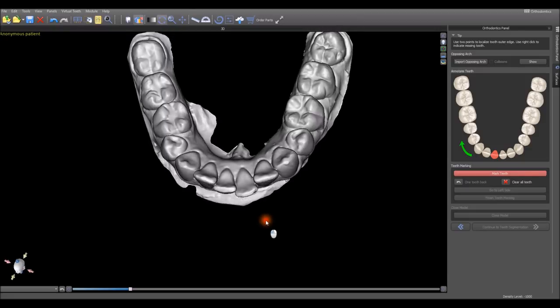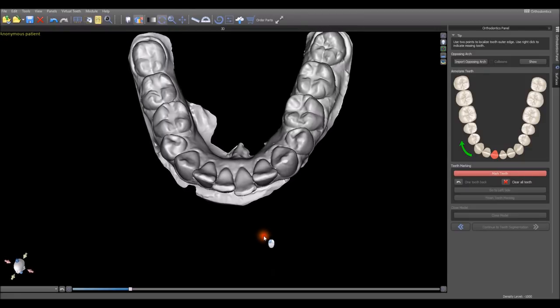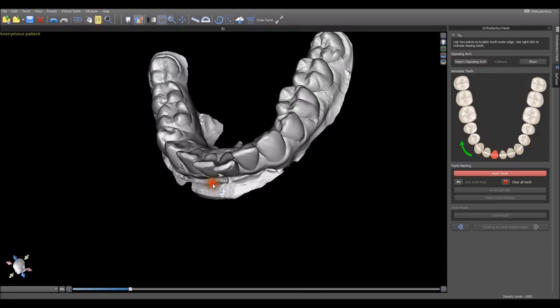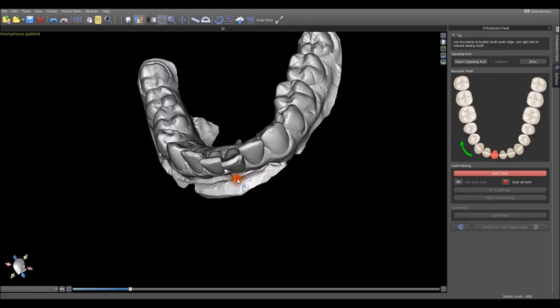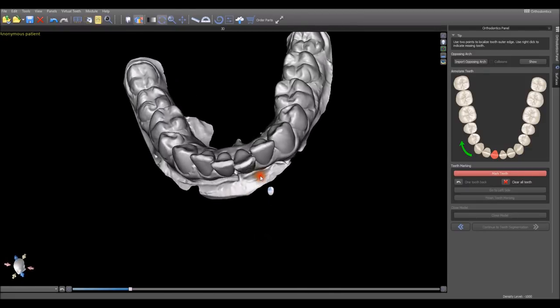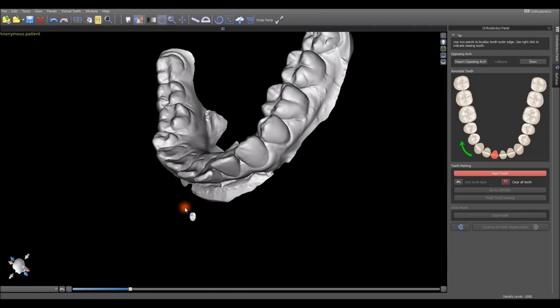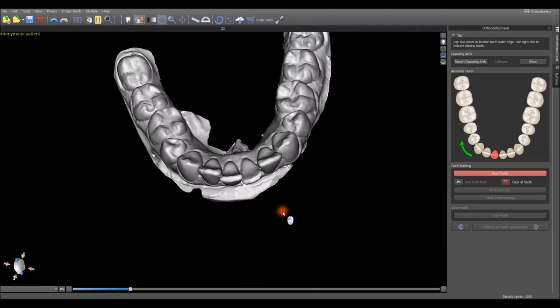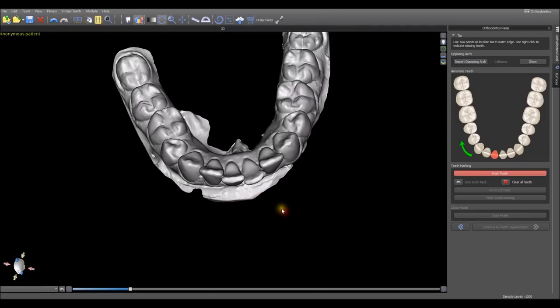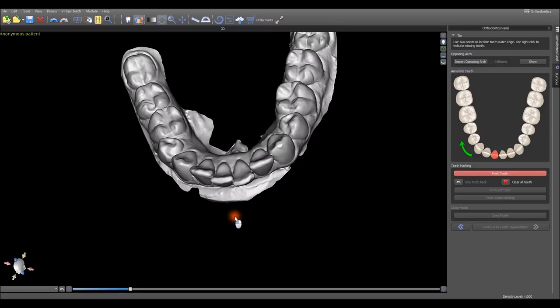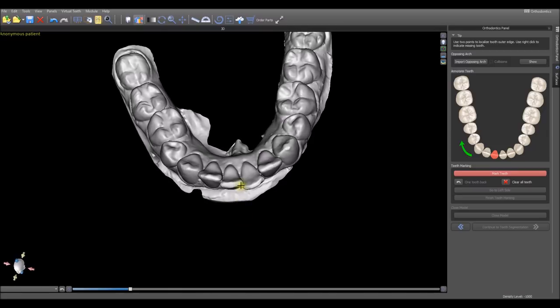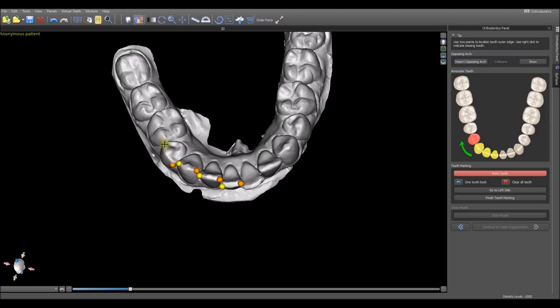We're going to proceed by marking the teeth. Rotate the model by holding down the left mouse button. To mark the teeth, hold down the Shift key and left click. You want to place two dots on each tooth on the buccal side corners of the teeth, and go around the arch doing this for all the teeth.